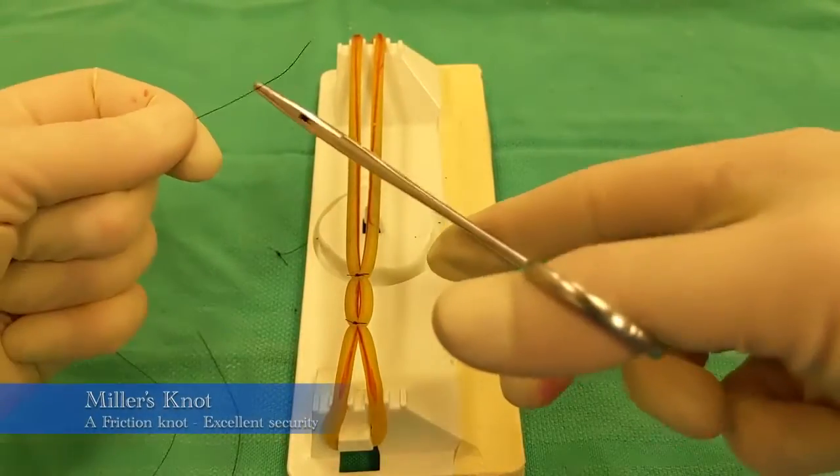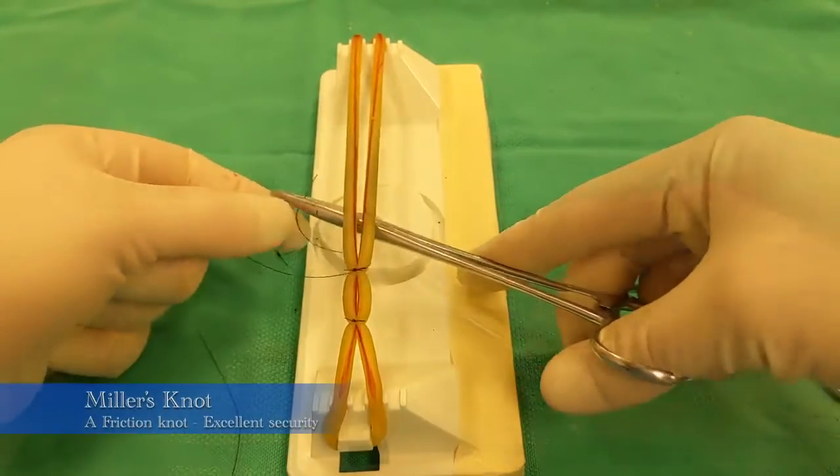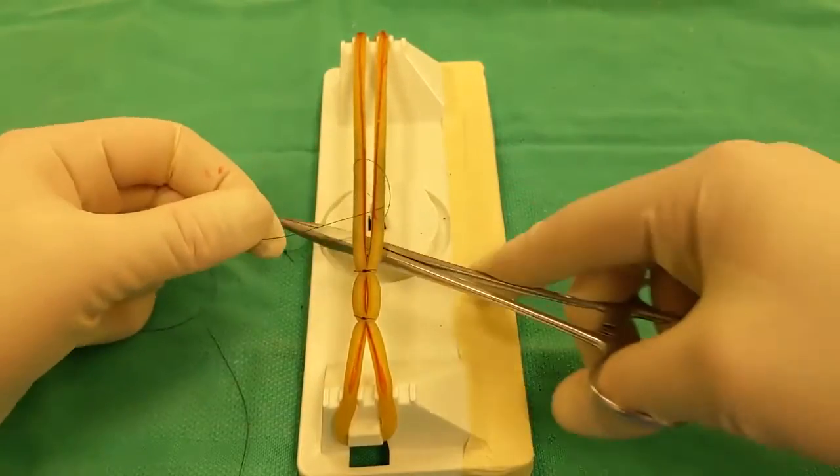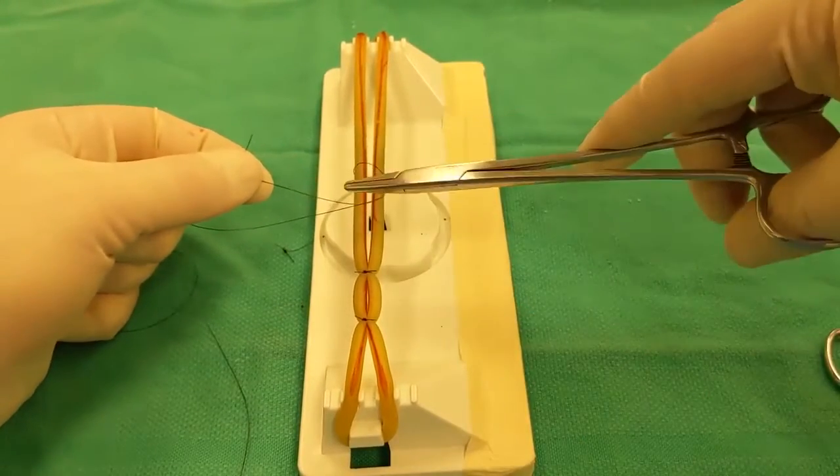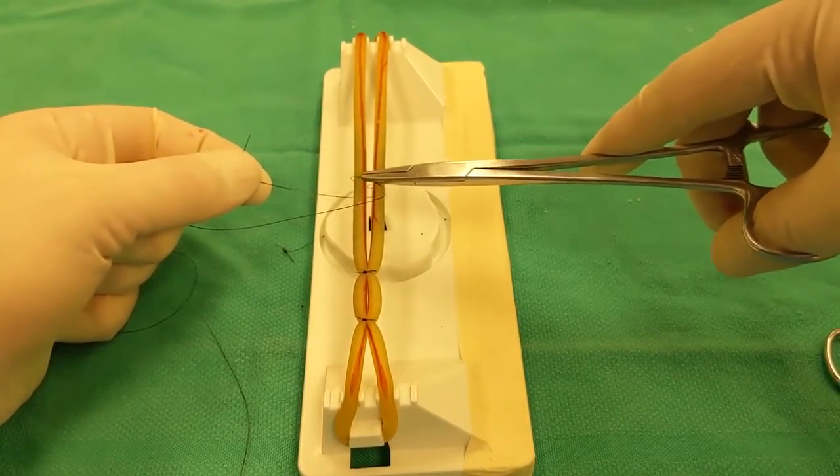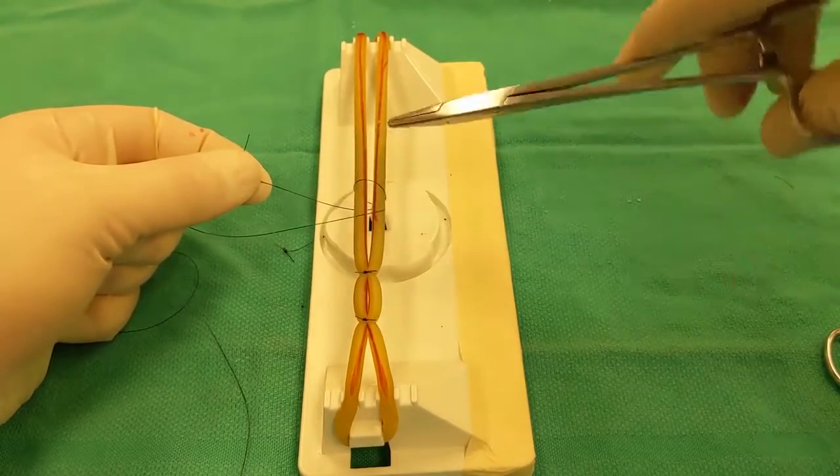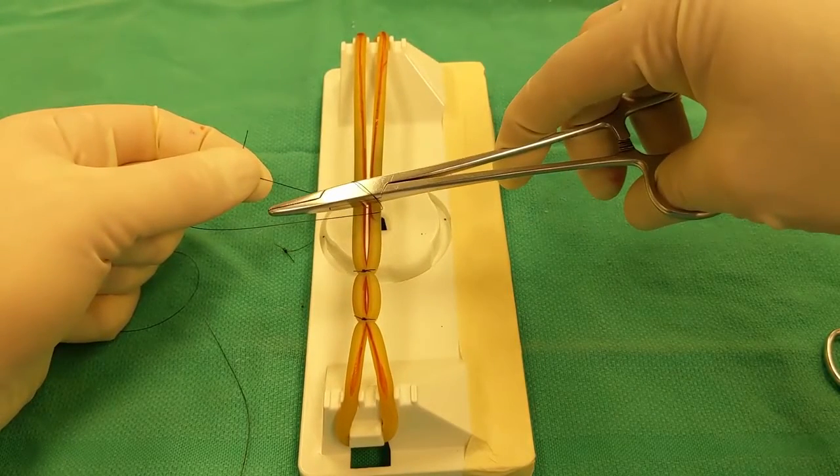To perform a miller's knot, the strand is first wrapped twice over and around the pedicle. Maintaining control of the suture tag with that left hand helps improve efficiency. So now we've created this loop, and you don't have to pay too much attention to where the loop is. It can be moved around, but what you'll do is you'll place your instrument through that loop.